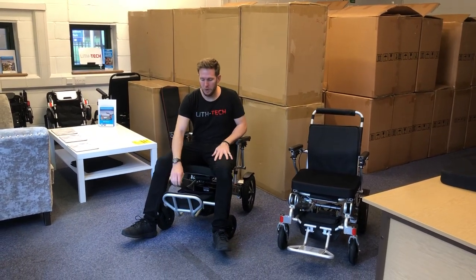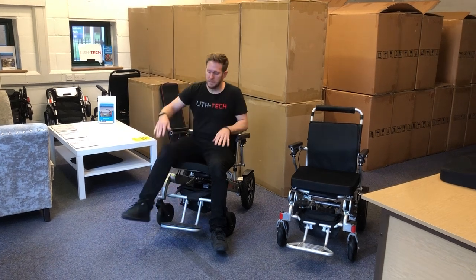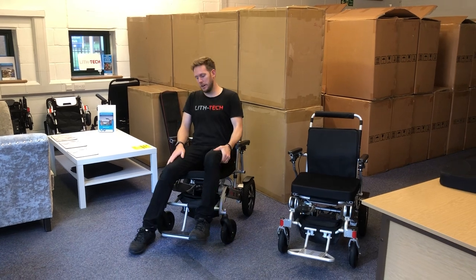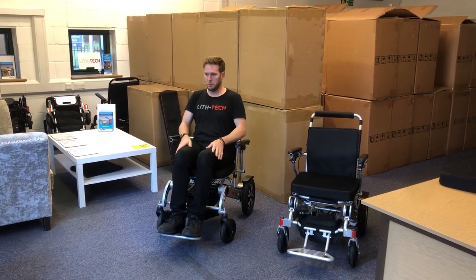You spread your legs at this point and your foot plate kind of goes back down, and then you can either put your legs over, or if you have not much use of your legs you can lift your legs up onto the foot plate — no problem at all.